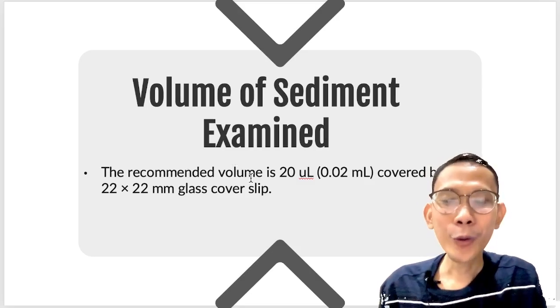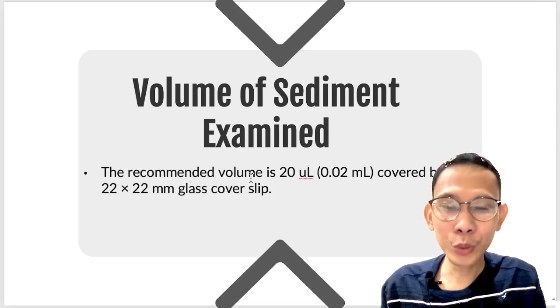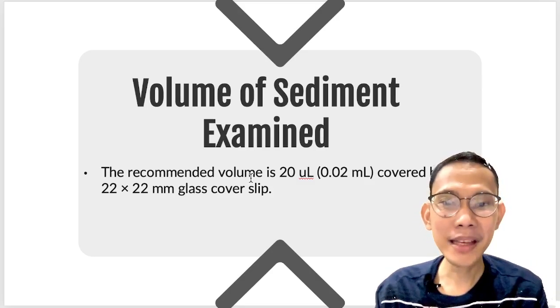So, ako personally, through time and experience, wala na ako cover slip. But again, you are still training, you are still learning. We still have to do what is ideal. You still have to follow the guidelines based on the book.